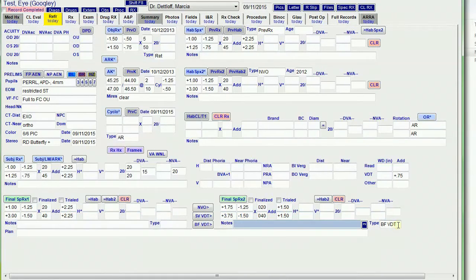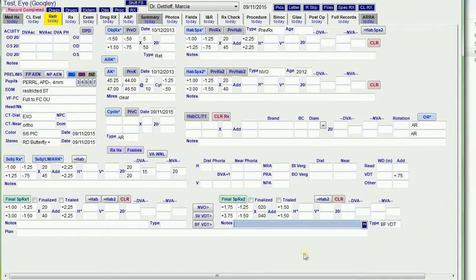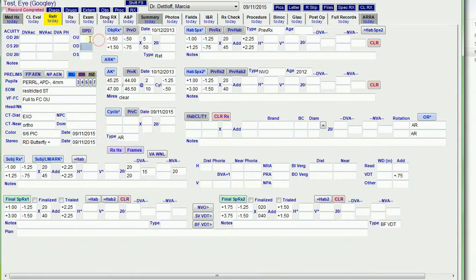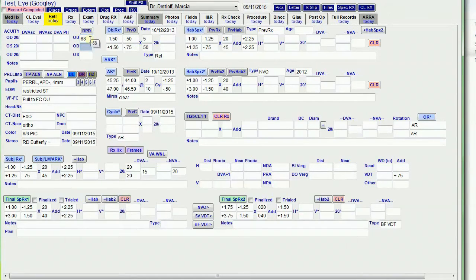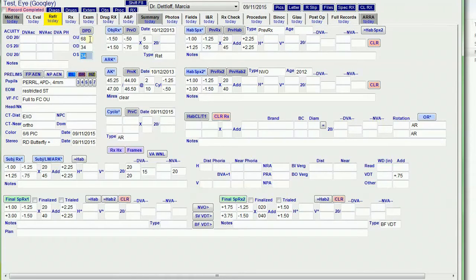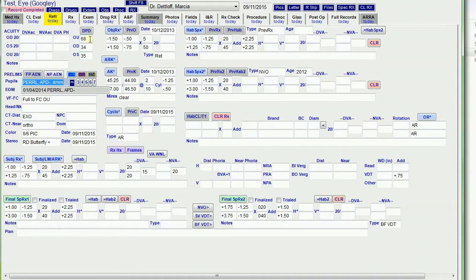And it writes over here bifocal VDT in the notes. Let me put a PD in here. And the PD fields, the right eye copies down to the left. So if I put 68 here, if I do 34, it copies down to the left eye. If I want to change that, the cursor is still there so I can change it to 35 or whatever I want.